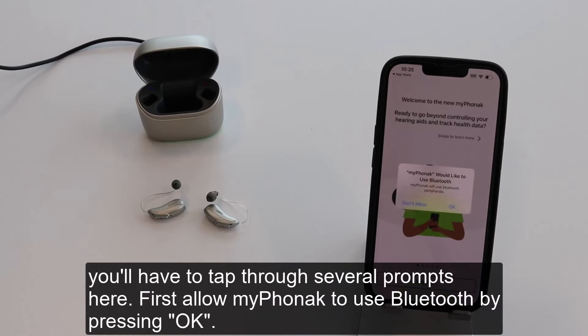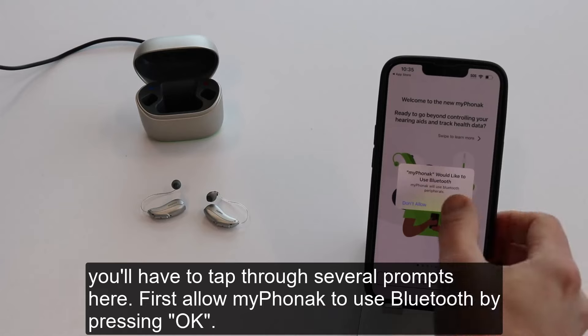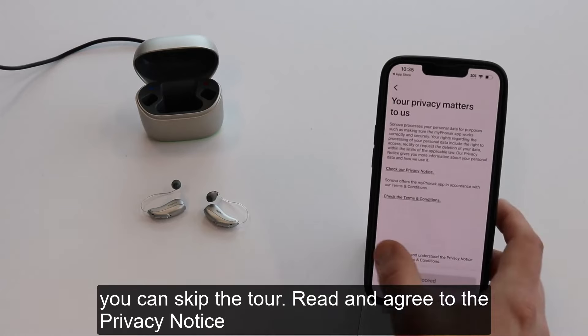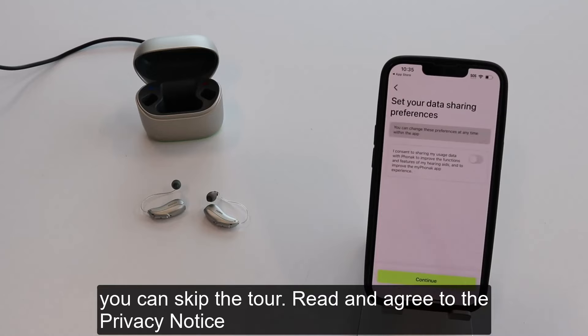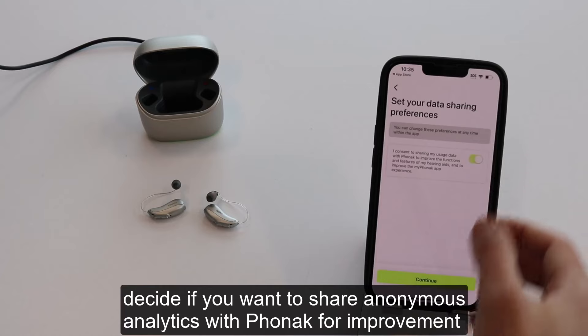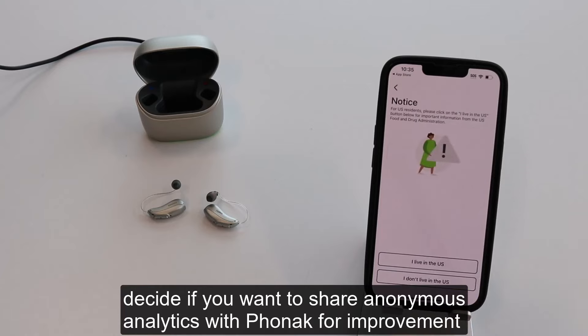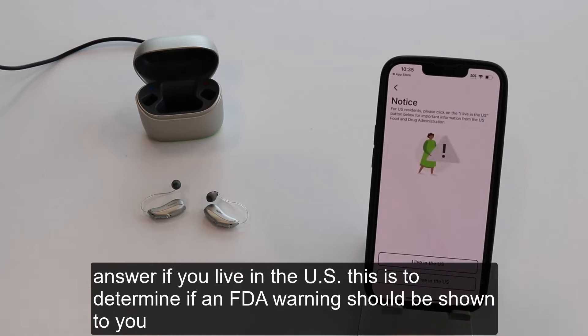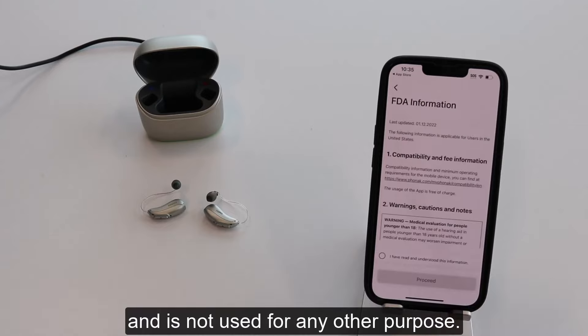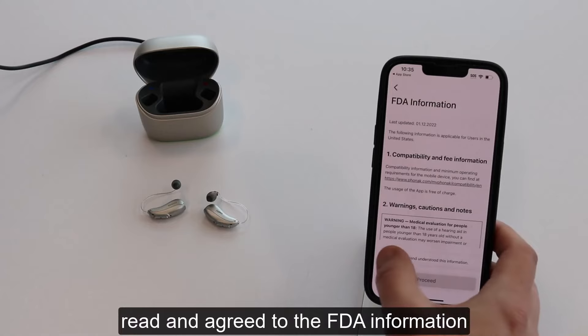You'll have to tap through several prompts. First, allow My Phonak to use Bluetooth by pressing OK. You can skip the tour. Read and agree to the privacy notice. Decide if you want to share anonymous analytics with Phonak for improvement. Answer if you live in the US — this is to determine if an FDA warning should be shown to you and is not used for any other purpose. Read and agree to the FDA information.